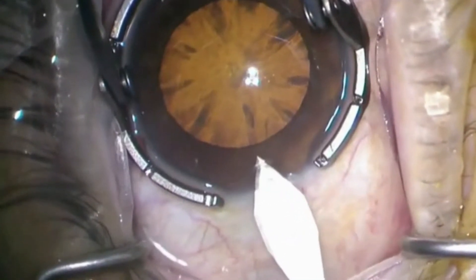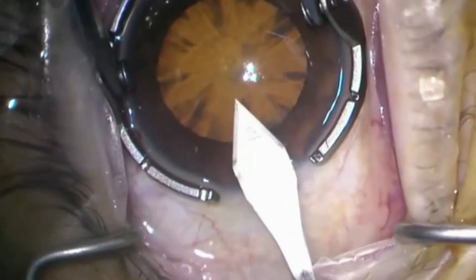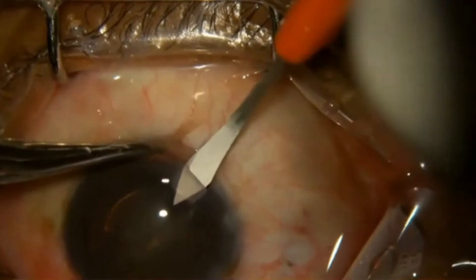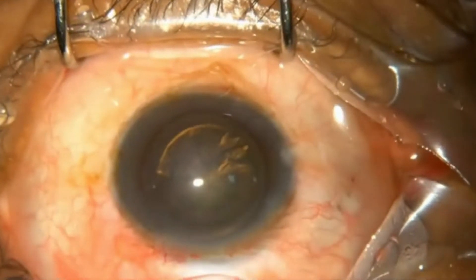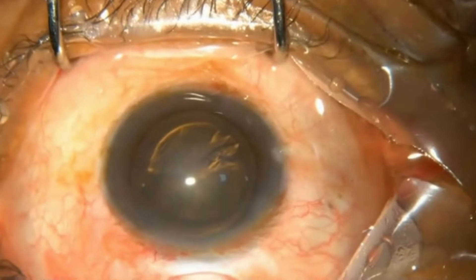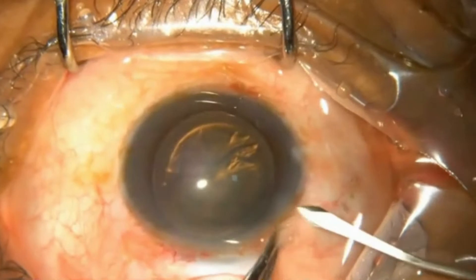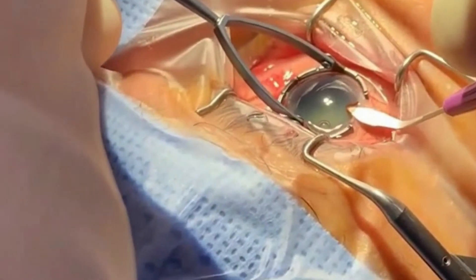Steel blades have a large surface area and help the faces of the incision to approximate and seal. These blades are reusable up to 10 times without significant loss of sharpness. The shielded configuration of blades helps to avoid accidental injury and protect the finish of the blade's edge. The safety shield on the crescent blade can interfere with the creation of the groove, so surgeons often prefer an unshielded crescent blade.